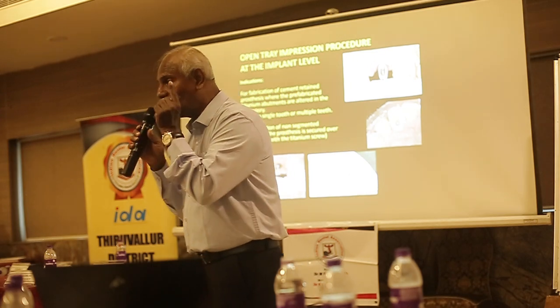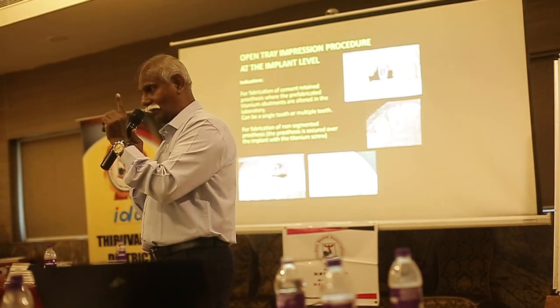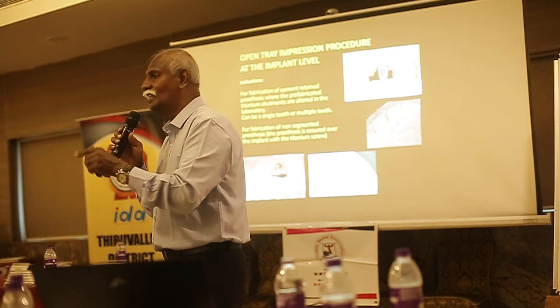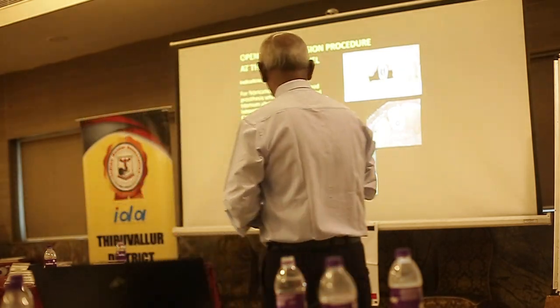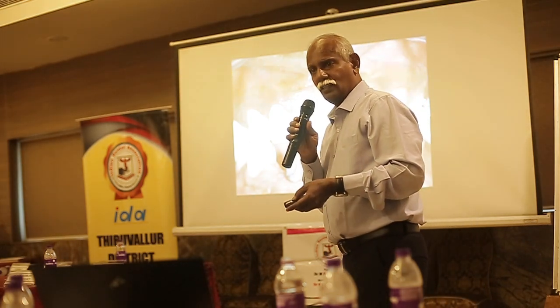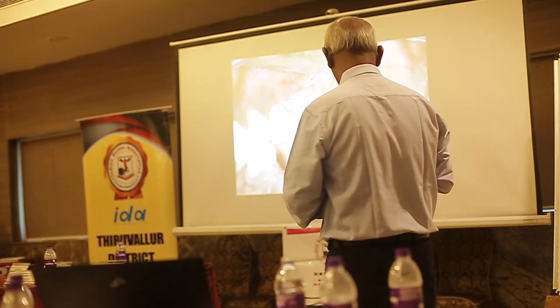For that purpose, what are called burnout plastic castable abutments are available. Okay? Burnout plastic castable abutments are available. They do a regular casting and they do the ceramic, and it is directly secured upon the implants. So these are some of the cases where we made the impression at the implant level and the abutments are modified.